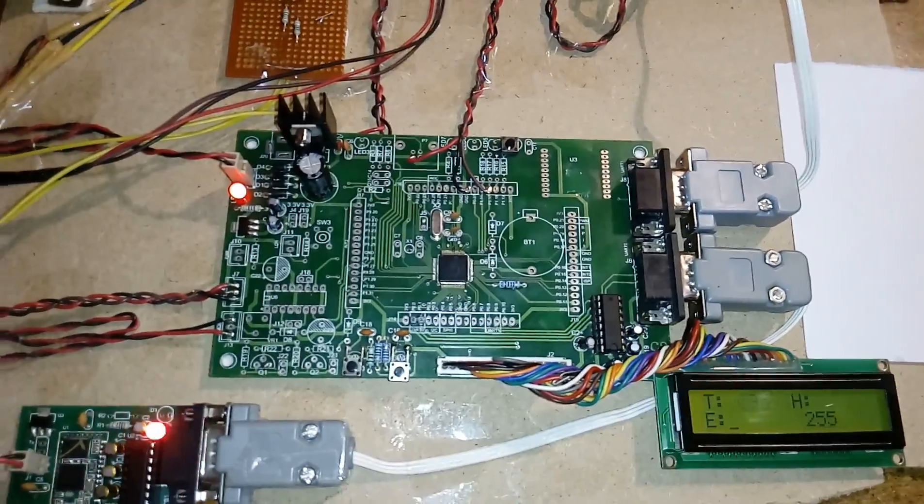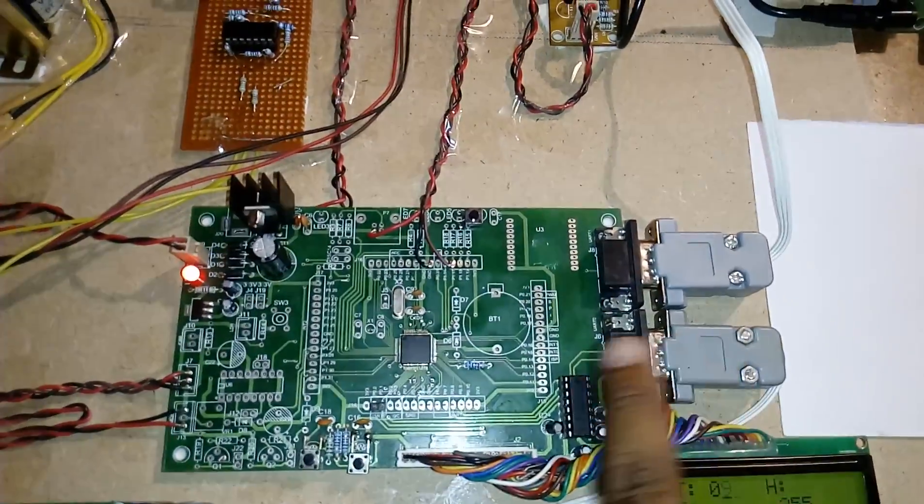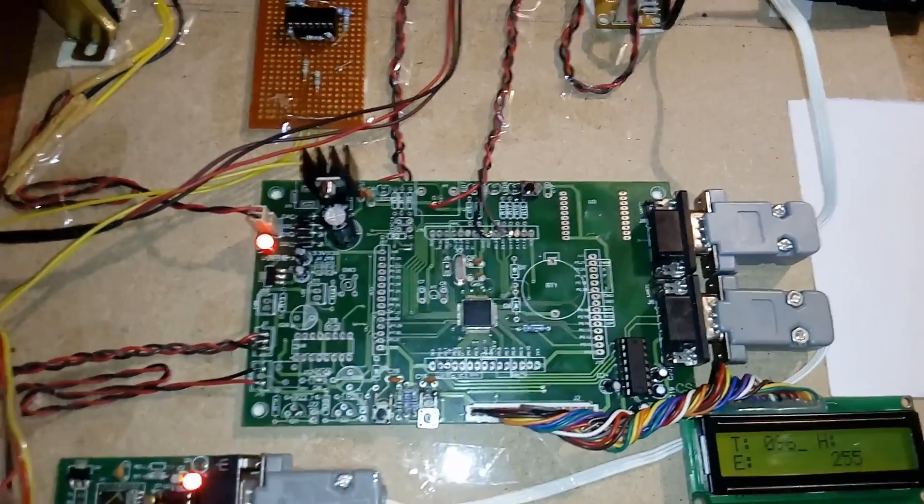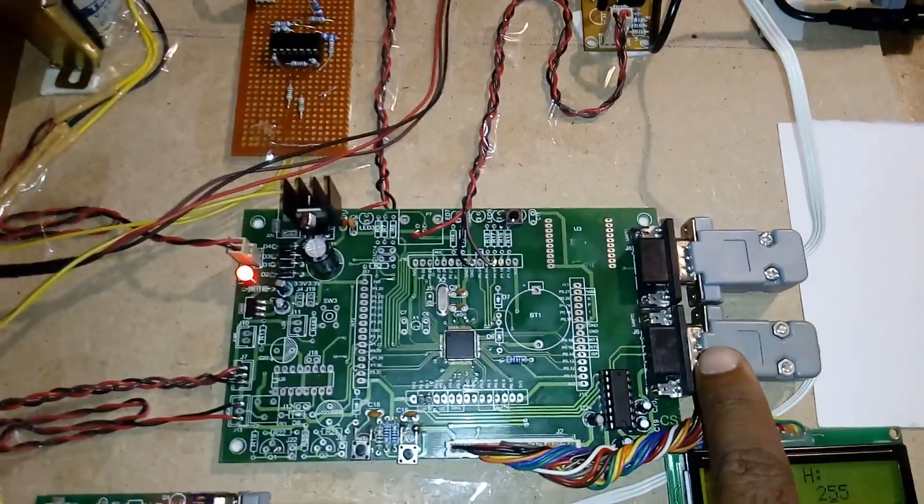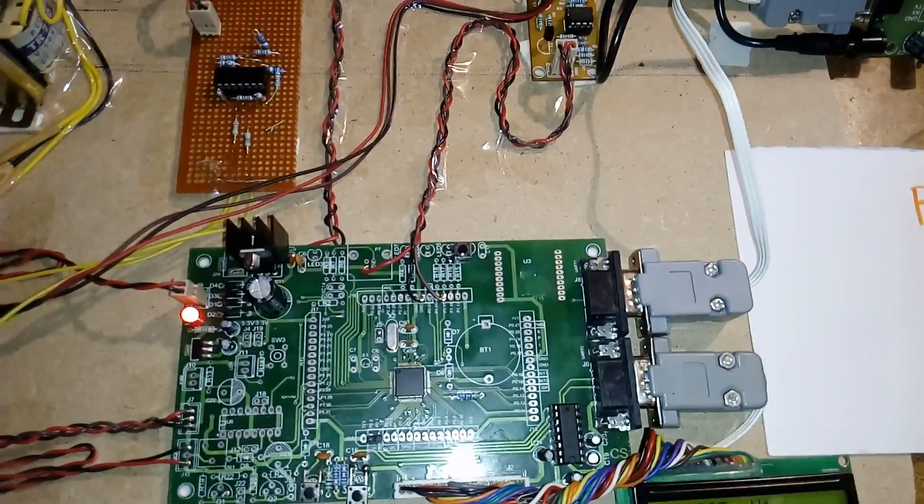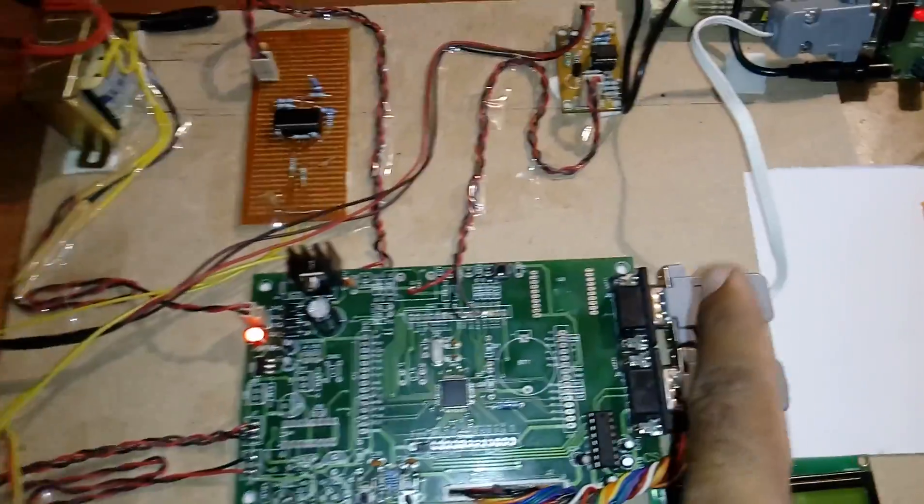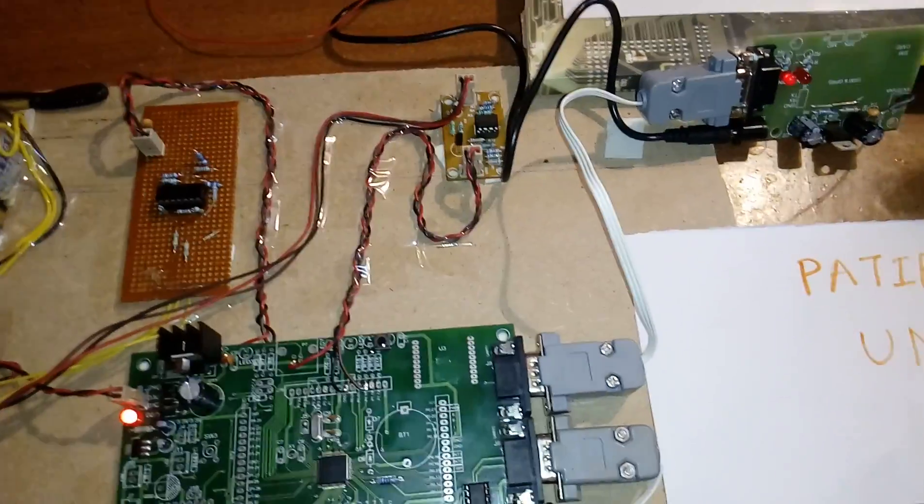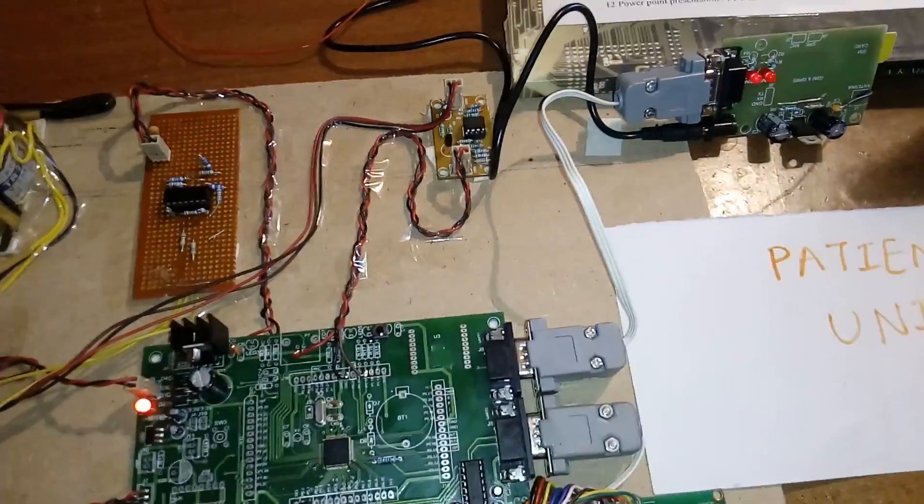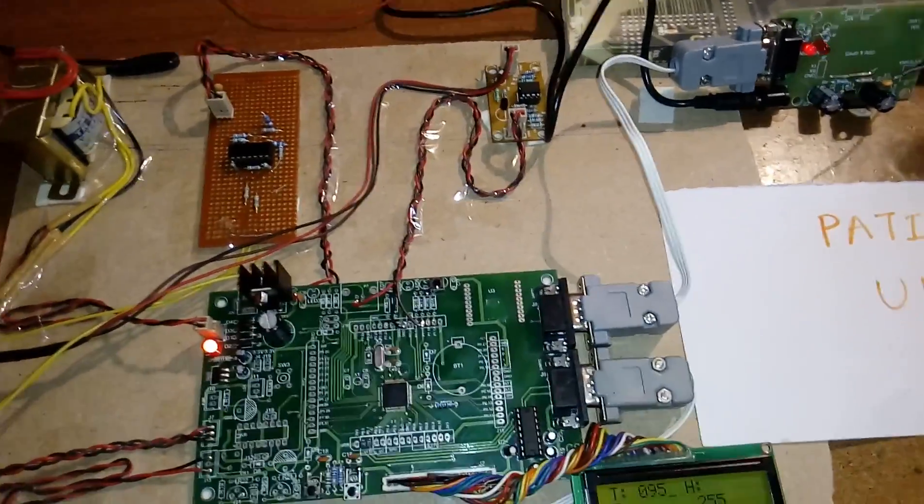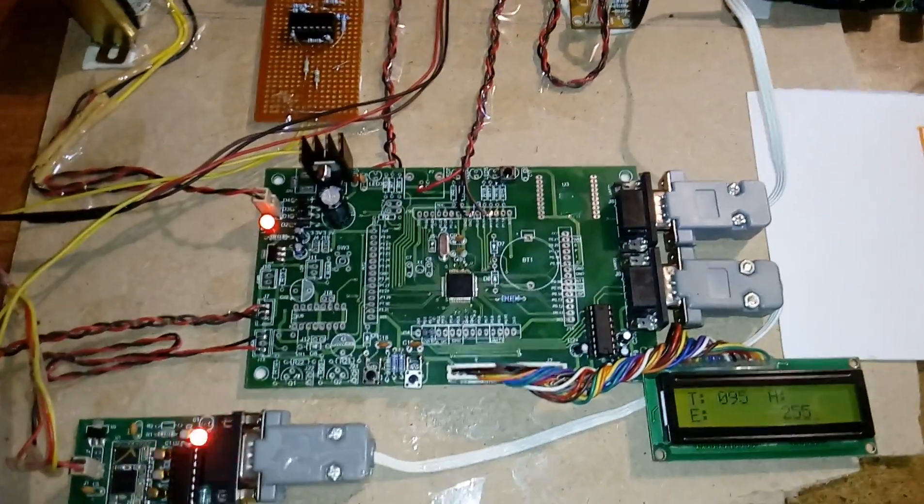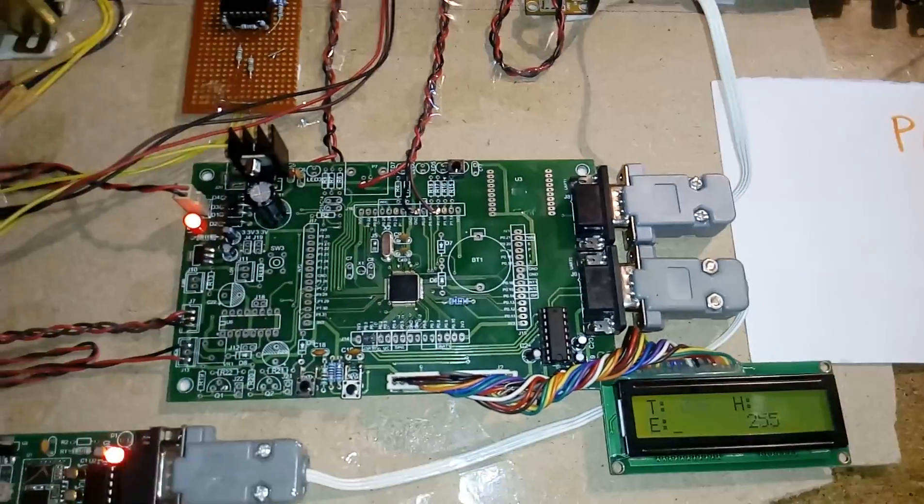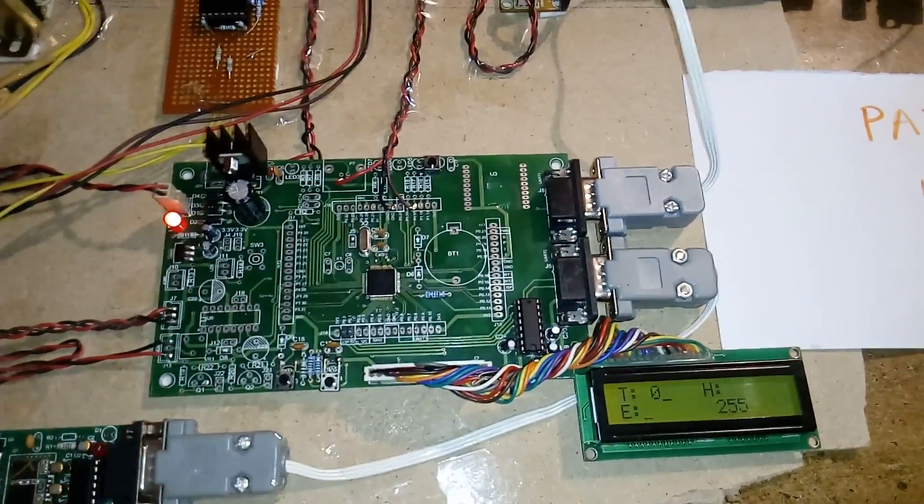Here we have a 12 megahertz crystal, the heart of the circuit for the controller to generate clock pulses to the internal CPU to run the program. We have one ISP button and one reset button. ISP is in-system programming. When we want to dump the program onto the controller we must press the ISP and press and release the reset, then only the program will be dumped through UART0. In ARM processor we have two ports, UART0 and UART1. UART0 is connected to the Bluetooth module and UART1 is connected to the GSM modem.